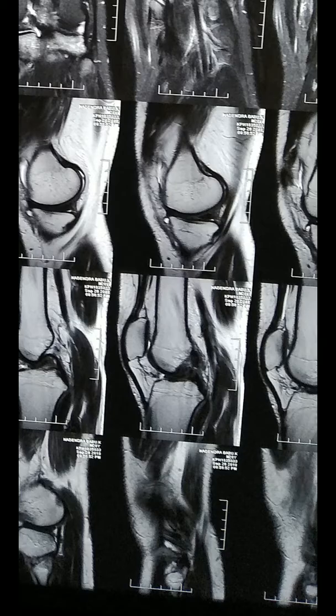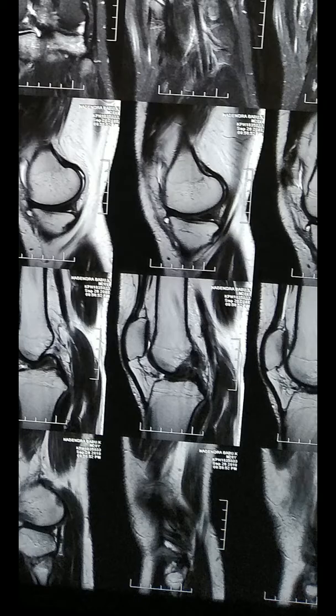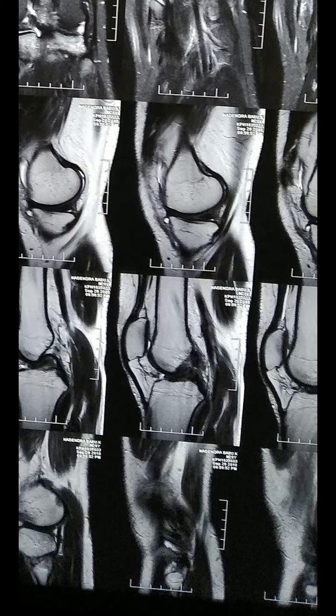To diagnose the ACL tear, you have to see both the primary signs and the secondary signs. Primary signs are very important. They are: discontinuity of the ACL fibers on T2, abnormality in the orientation - normally they are oriented parallel to the intercondylar roof, that is Blumensaat's line, or they are steeper. They are never less steep - if the ACL is looking flat, it means it is torn.